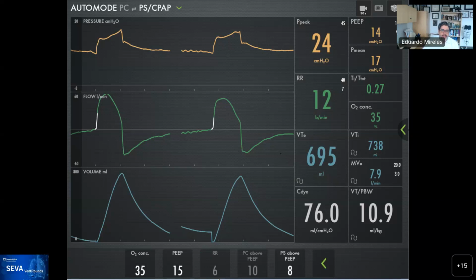And so these, if you notice, when we dropped the rate on the patient all the way to 6, the patient started breathing on its own and triggering every single breath, and the reverse trigger went away. Evidently, this patient has other features that tell you that there's toxicity, very large breaths, low respiratory rate, but it took away this problem.